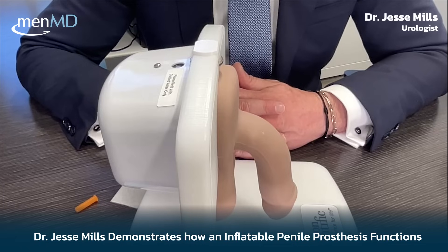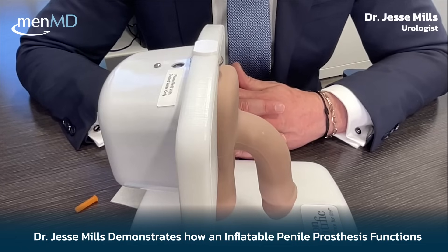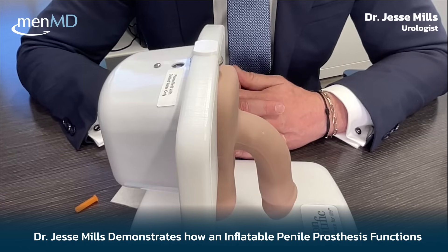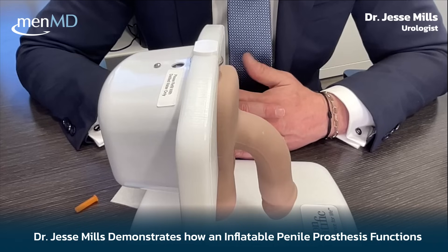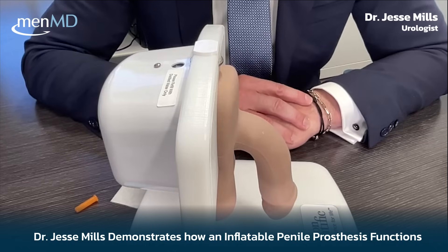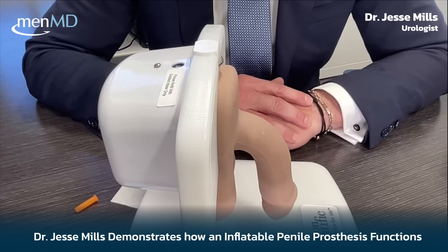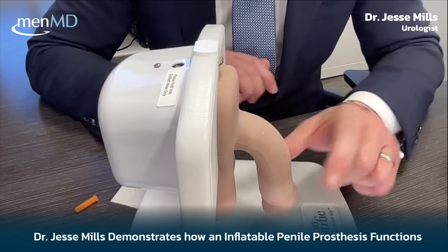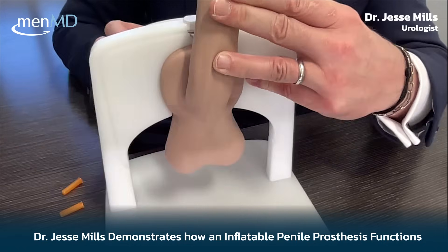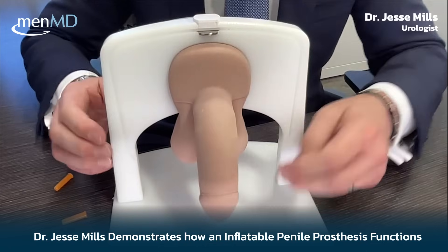If things are looking pretty good, we can think about activation. Most men, really between three and four weeks, we're able to start activating them so they can start having intercourse. You walk into the office and here's how things look: you have a flaccid penis because your implant is deactivated. As you can tell in this model, the incision has healed.